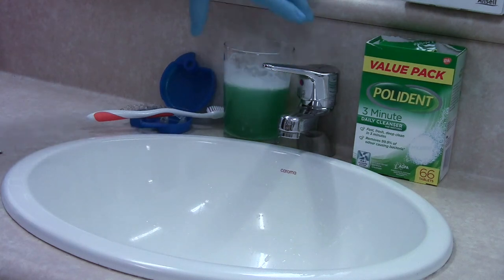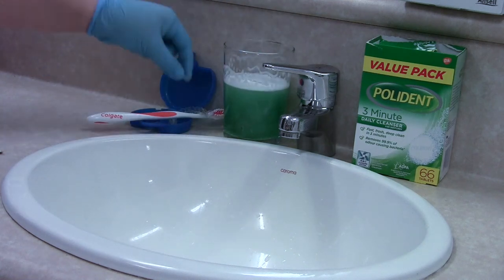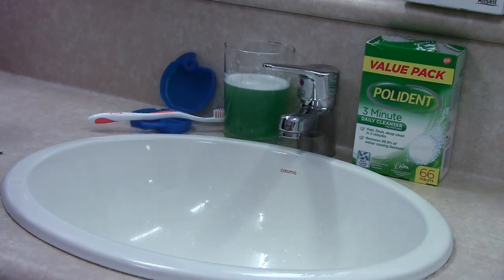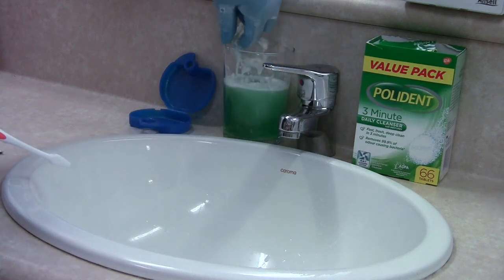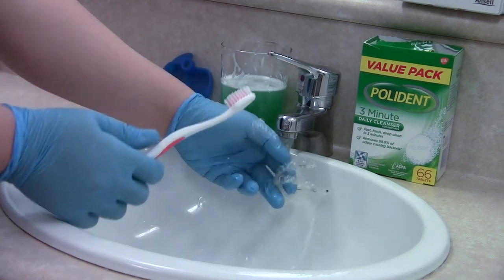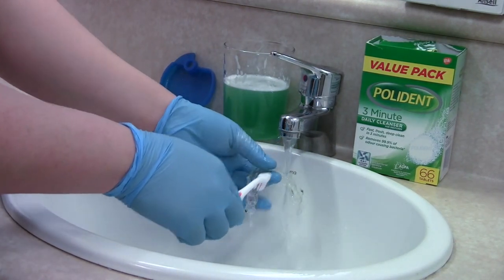After the tablet has fully dissolved, soak your aligners for around 3 minutes. After 3 minutes, take your aligners out and rinse under cold water. Using your soft toothbrush, gently scrub it before putting it back in your mouth.